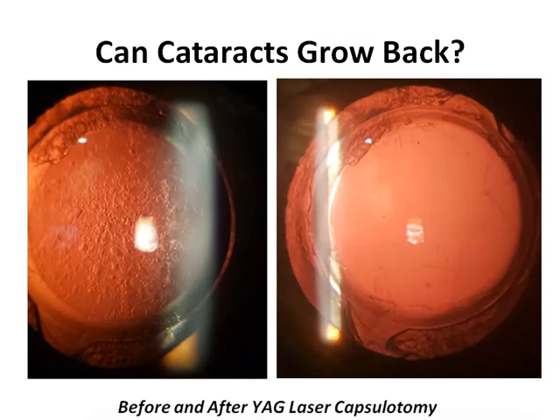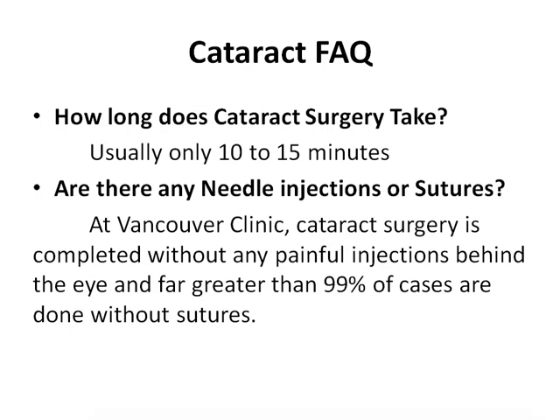or IOL, is placed. It's fairly common for the leftover capsule to become cloudy long after surgery. This is referred to as a secondary cataract because many patients experience similar symptoms to when their cataract first occurred. Approximately 1 in 4 patients will have this occur within 5 years of surgery. Fortunately, this can be safely addressed with a totally painless and incredibly safe 2-minute laser procedure that is done in clinic rather than back in the operating room.